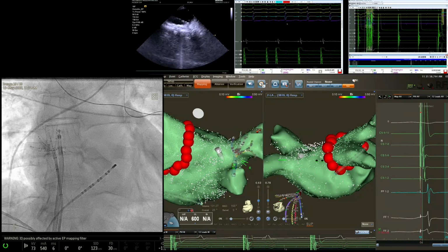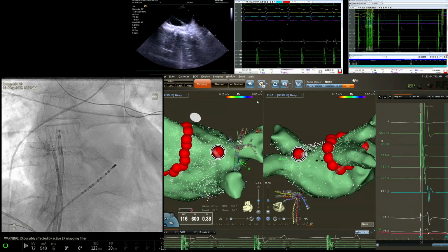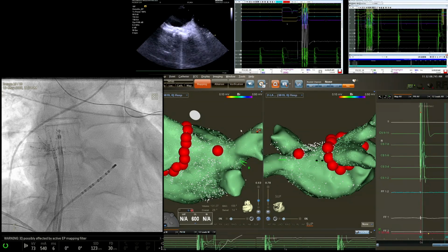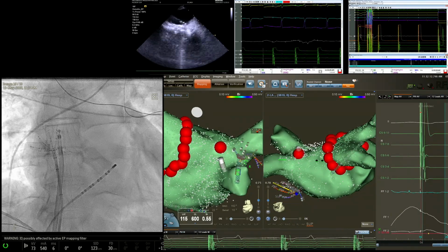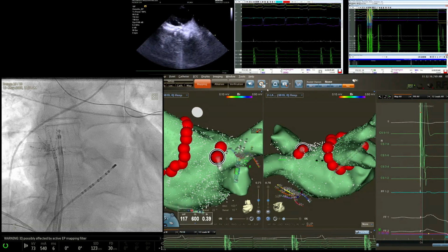All right, Chief, let's. Okay, let's take that point right there. Okay, hide, magnet off, ablation. So that's the ablation. I'm not moving it. You can see the electrogram has disappeared. Now I'm going to move down to what we think is the next location. Point, hide, ablation.